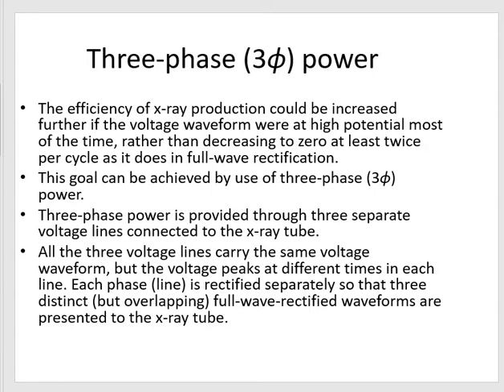It's from 40 or 70 kV up to 150 kV for the acceleration of electrons from cathode to anode, but only up to 10 volts for the filament. So there is a need for a system to modify the voltage supplied by the generator.